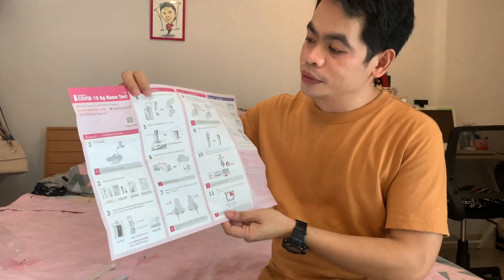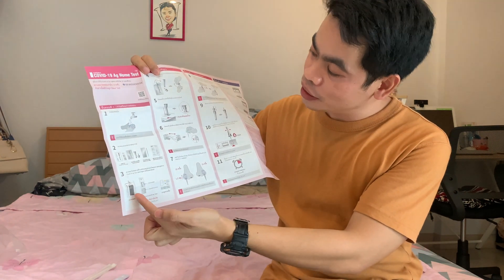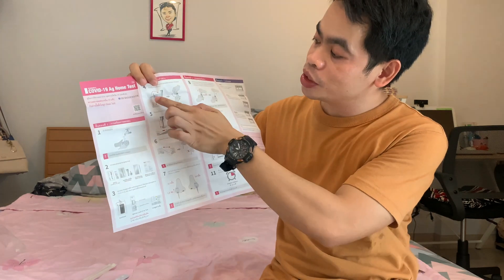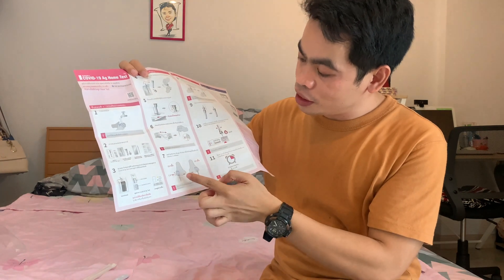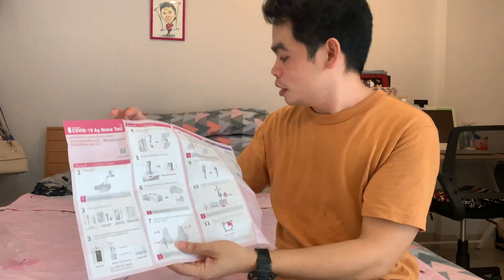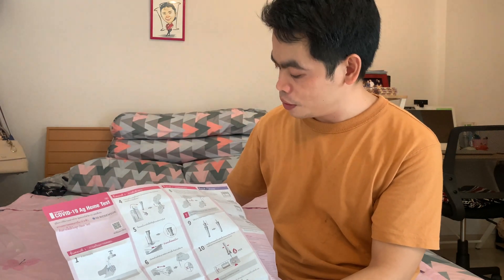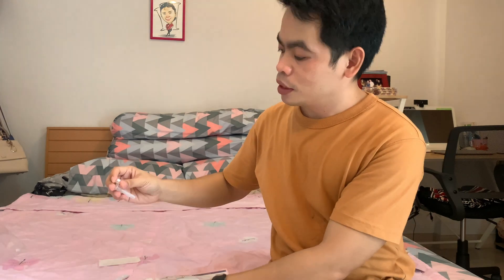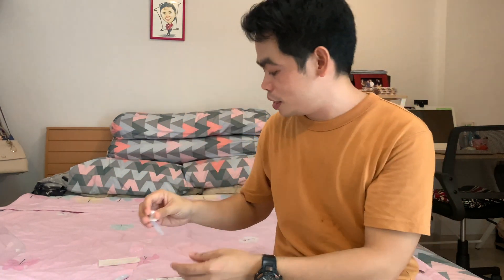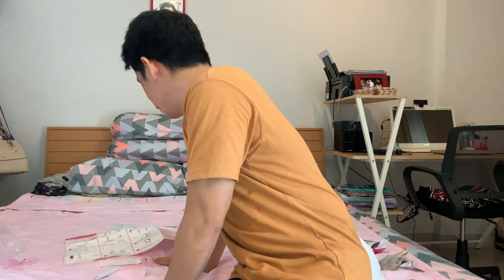Here's the direction — it's in Thai, but you can see the pictures. Wash your hands and open everything. Then open and put the swab in your nose, and after that put it in the solution. Then we put the nozzle cap to cover it and put the solution drops here. Let's see if I'm doing it right.